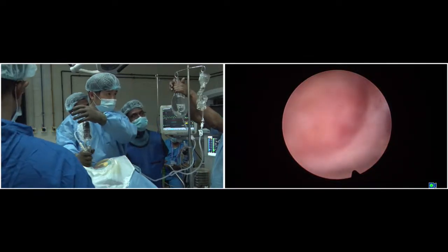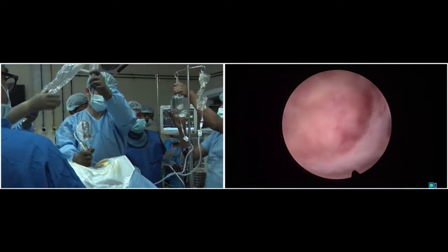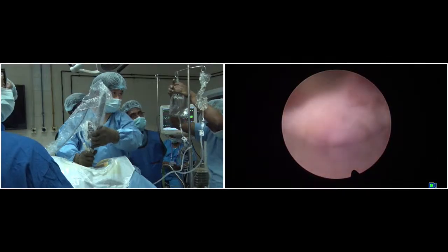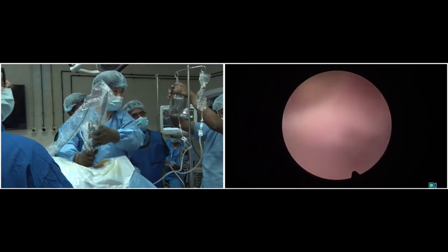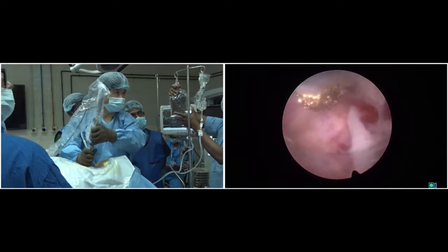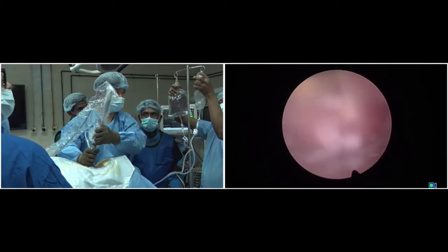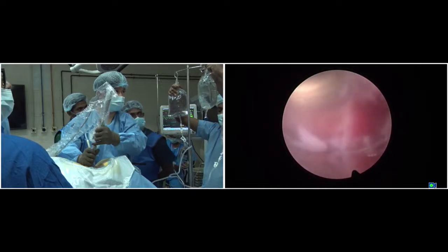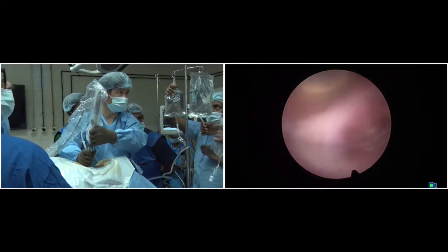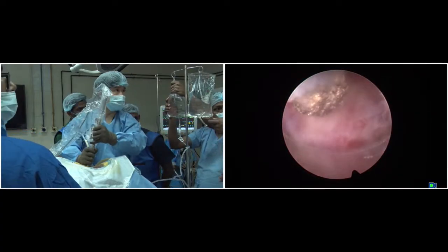Drill. Low pedicle. Low pedicle. Here looks like a pedicle here.